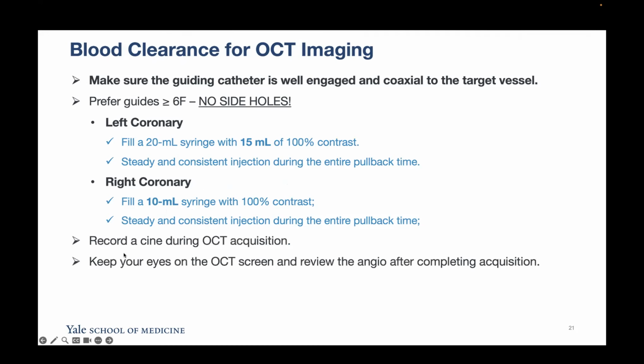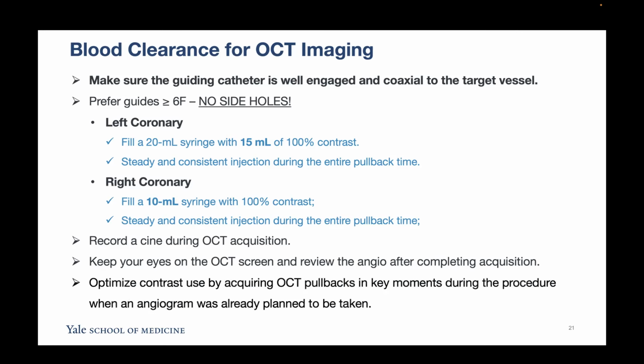I always recommend that since you're injecting contrast, you record a cine during OCT acquisition and keep your eyes on the OCT screen. We have the tendency, as operators, to look at the angio when you inject. So when you start injecting, you see that the vessel is opacified by contrast, and you stop injecting because it's intuitive. But you still need 1 or 1.5 seconds more of injection to complete the run. So keep your eyes on the OCT screen until you see the catheter coming back to the guiding catheter. And then you can review the angio after completing acquisition because you saved it for recording.